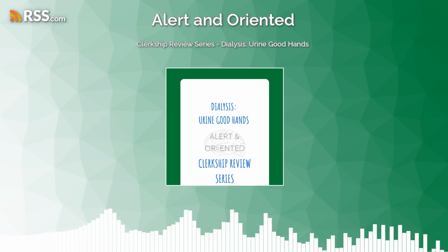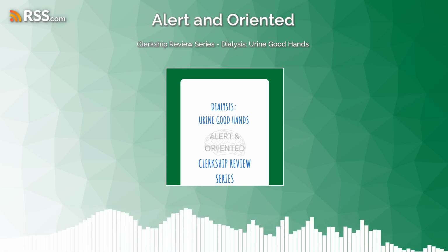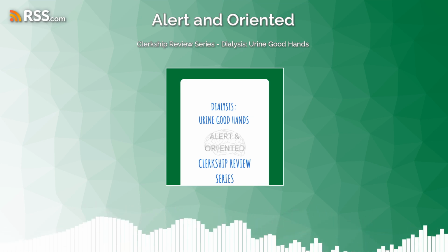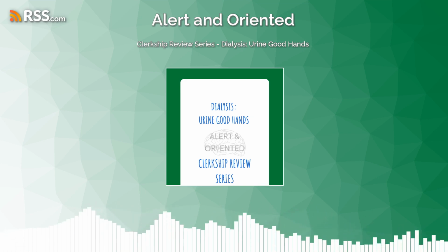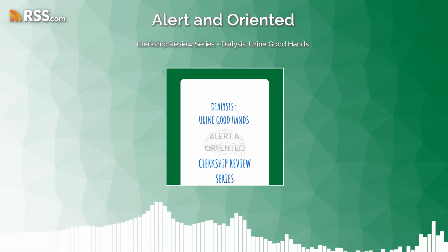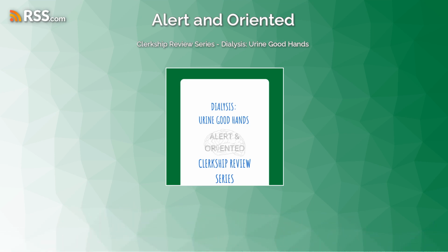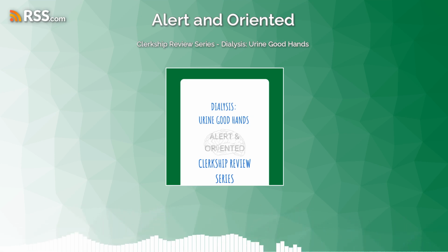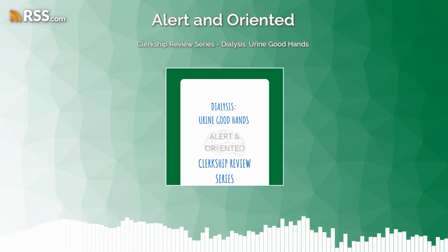You can still deliver the same dose, clean the blood the same amount, remove the same amount of fluid, and not really compromise the patient or the goal of the renal replacement therapy. But staff and utilization of your resources can actually be improved with some of these hybrid treatments. So that's one of the considerations of which modality we use as far as continuous versus intermittent versus hybrid.